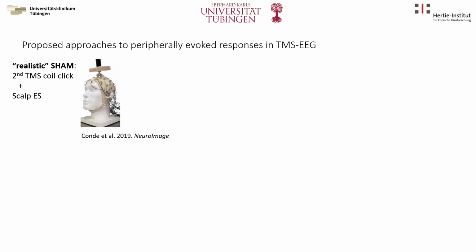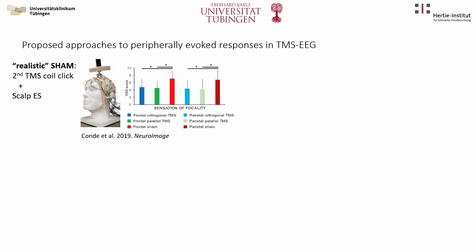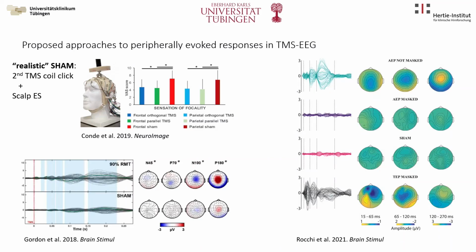And that's what people have been doing in the past few years, using this kind of idea to try to recreate the sensory input from TMS as a control condition. However, it's hard, and people haven't been very successful because, for instance, it's very hard to perfectly pair the sensory stimulus from the TMS and the sensory stimulus from the sham coil. People can tell the difference. And if people can tell the difference, what may happen is that when you do your study, you find that your sham condition generates a peripherally evoked response that does not really match the one from the TMS. So some studies have fallen short on that, including one by yours truly.